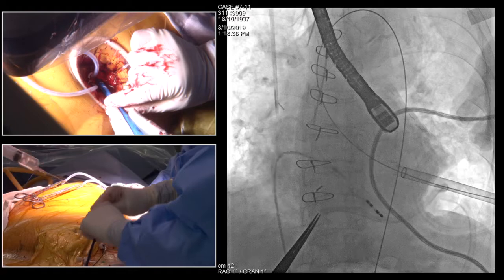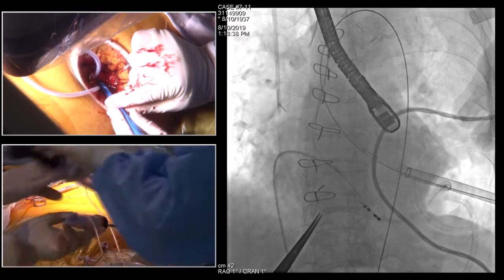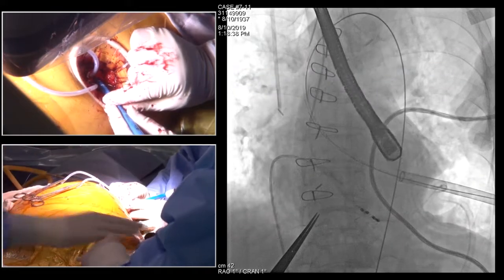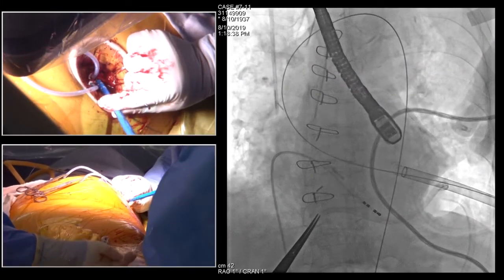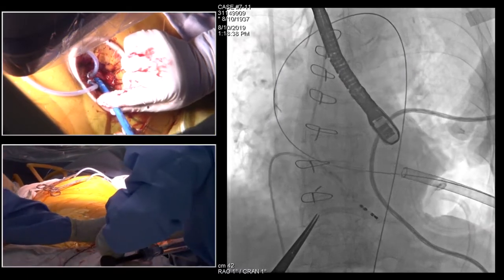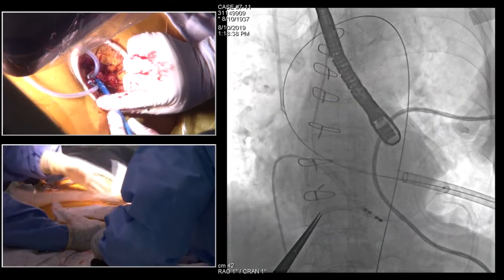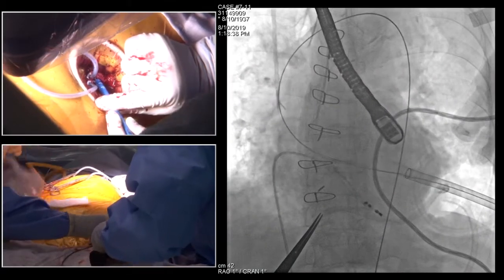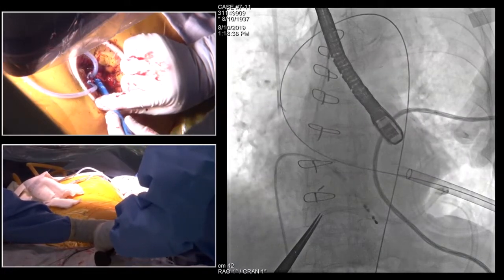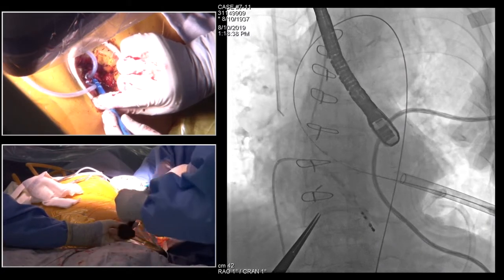No, I think what has happened at our center is we are not super aggressive about pushing the femoral. There are many centers that will do almost anything. We do alternative access in 10% of our cases because we will do almost anything to avoid traumatizing the femoral artery to try to cash the sheath. If they have a questionable femoral, we're very comfortable with the carotid approach because our experience has been good. But I think it's not for everybody. What I will say about the question on the insertion of the valve is that we access the common carotid below the bulb. Almost never after. Amazingly, very, very clean.